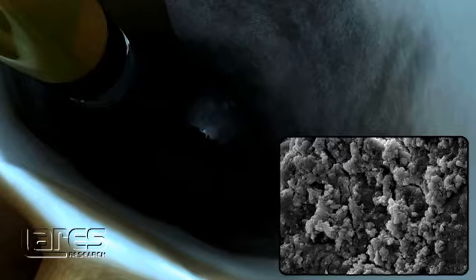This first SEM photo shows the smear layer present immediately following canal preparation after conventional filing. As we continue virtually downward into the canal, note that the placement of the PIPS tip stays stationary above the canal. The laser energy is activated into the tip, creating a series of shock waves traveling down the entire root canal system to its apical terminus.